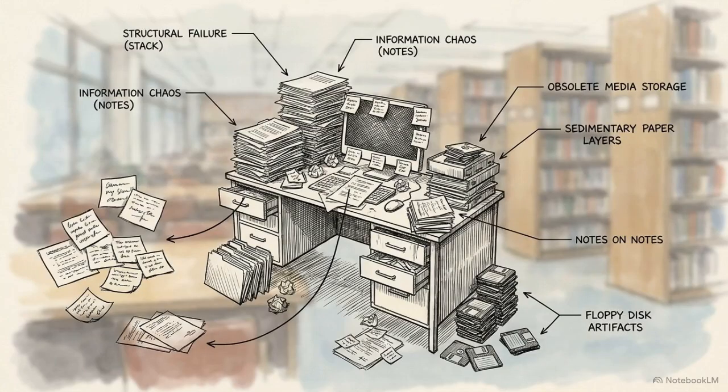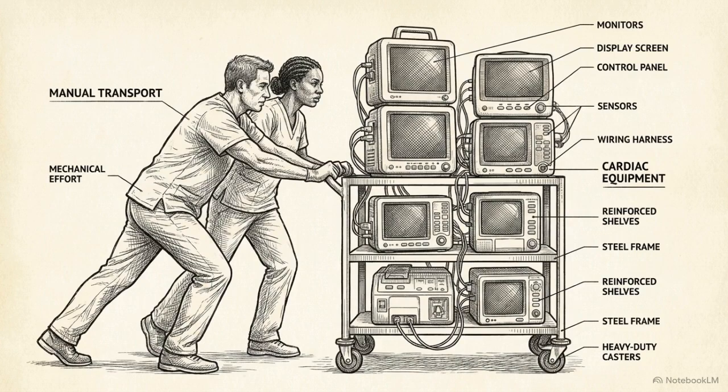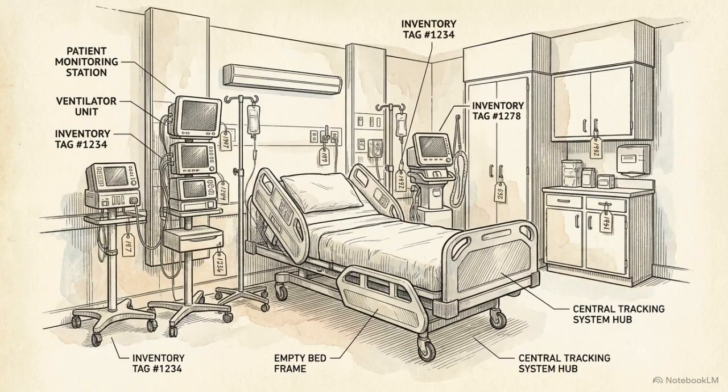If the hospital's tracking system is fragmented or outdated, the manufacturer's warning is useless. Staff will be unable to locate the devices before they are used on patients. Once the affected devices are successfully located, staff must execute an immediate isolation protocol, separating the items from active stock and clearly applying a recalled label. Precise, centralized tracking is the only mechanism capable of transforming an external manufacturer warning into actionable patient protection.